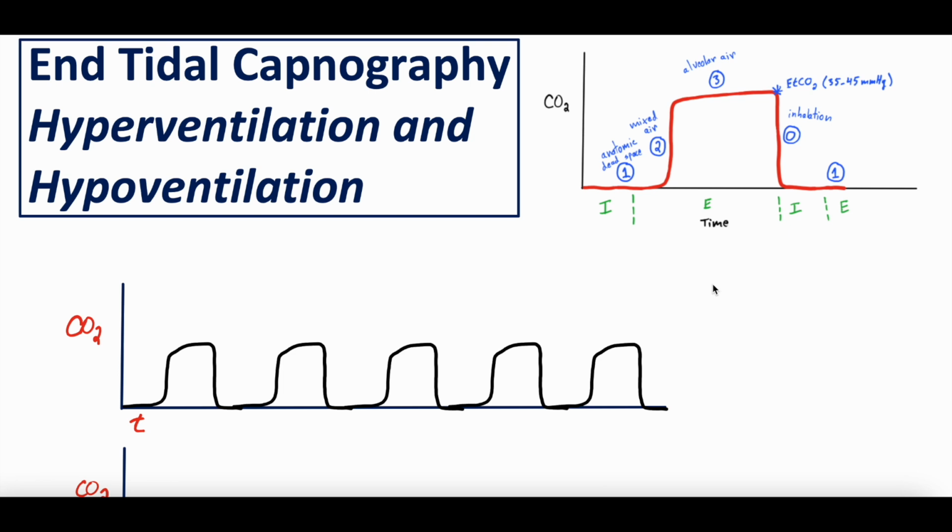Today is going to be another video within our series of videos on end-tidal capnography, or end-tidal CO2. Specifically today we're going to be talking about end-tidal capnographic tracings for hyperventilation and hypoventilation.